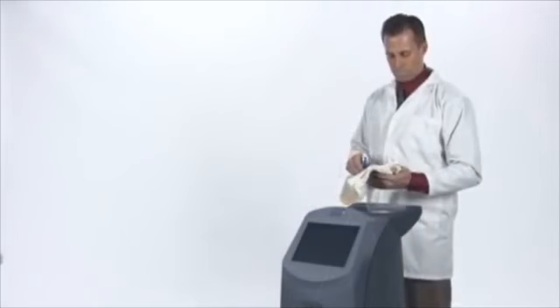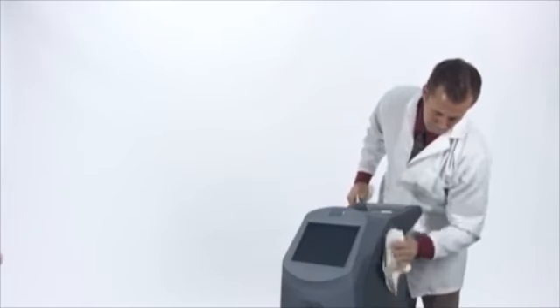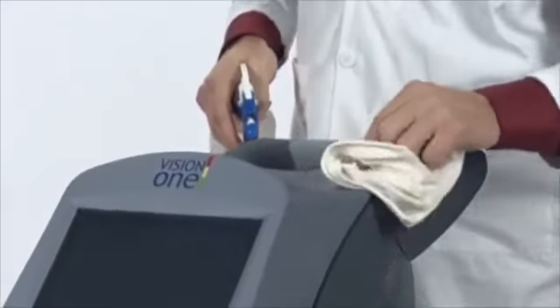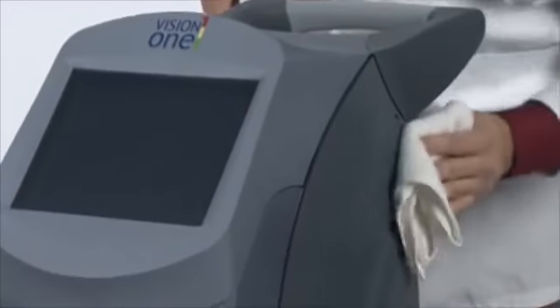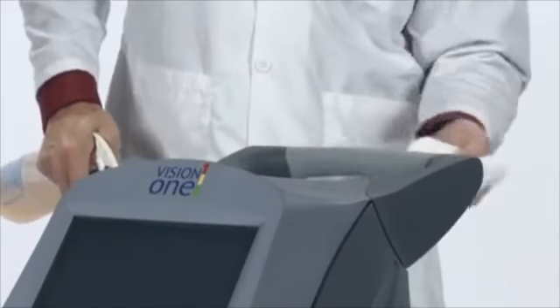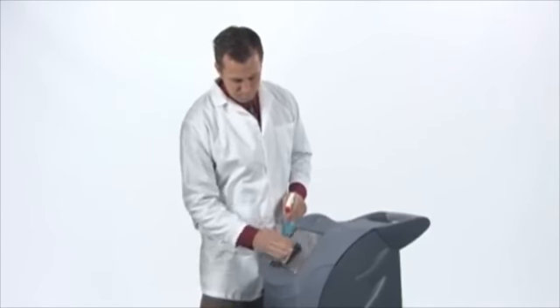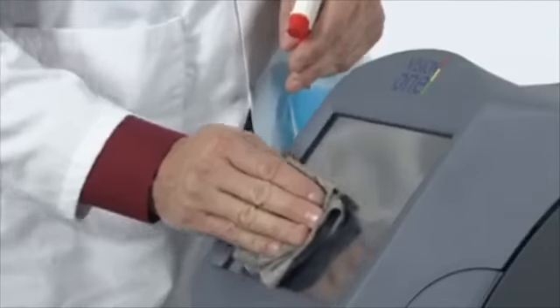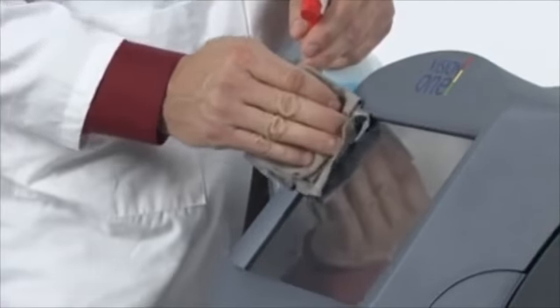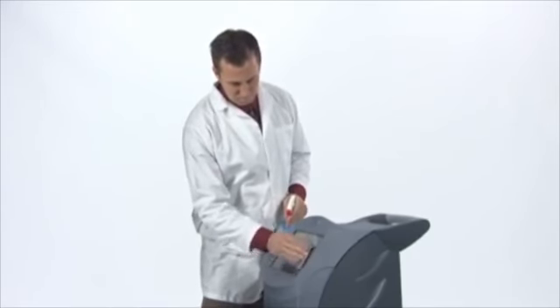Use a cloth dampened with a non-caustic cleaning solution such as soap and water, isopropyl alcohol, or a commercial disinfectant to wipe the external surfaces of the laser console. Dry with a clean cloth or allow to air dry. Clean the laser console at least once weekly. Use a soft cloth to apply anti-static glass or plastic cleaner to the laser control screen. Do not spray or pour cleaning agents directly on the laser console or control screen. You may damage the console screen and laser system electronics.